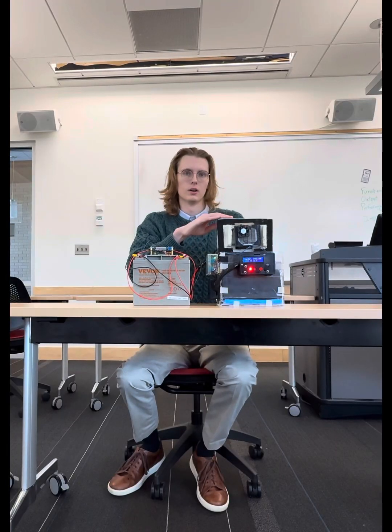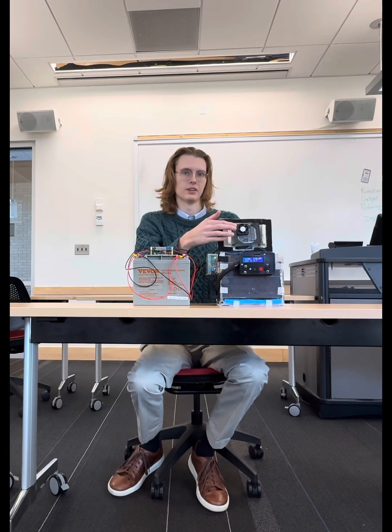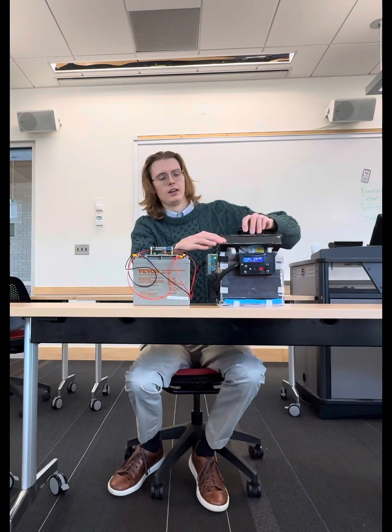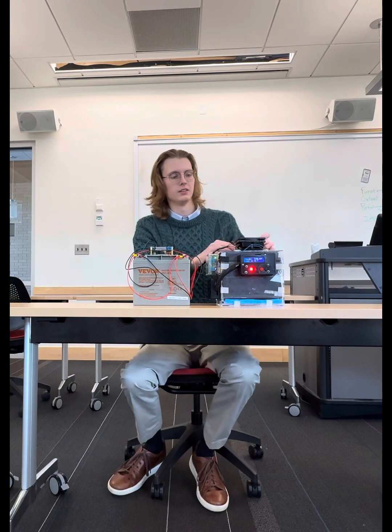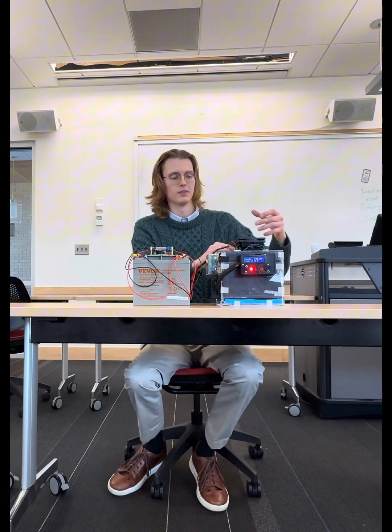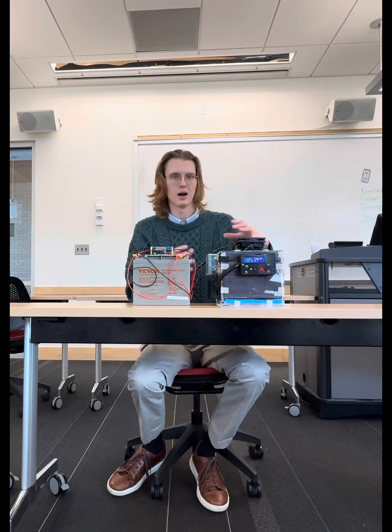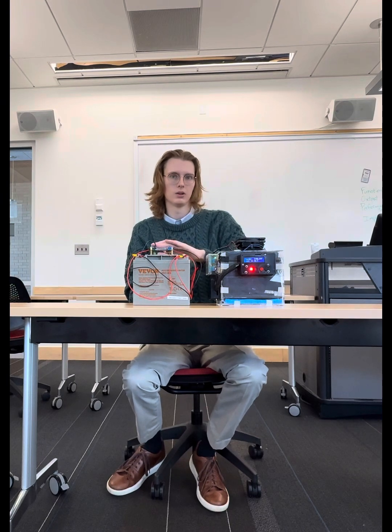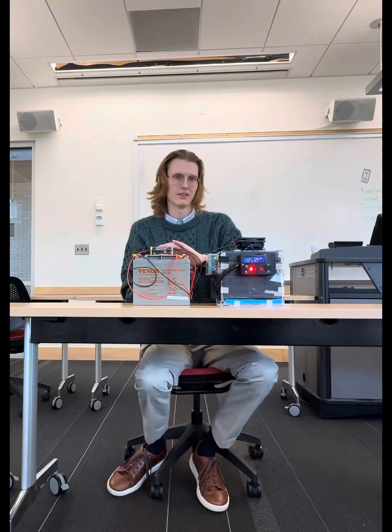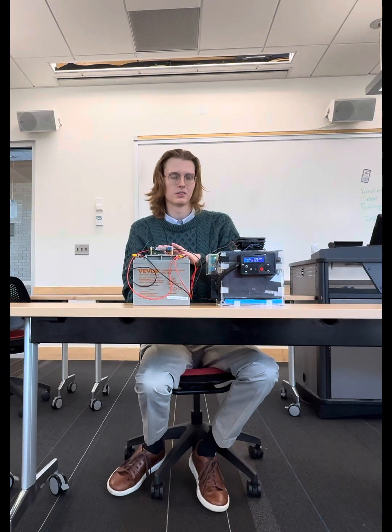So for our cooler, we use a Peltier to cool it down. We've got a heatsink on this side with a fan to get the air circulated across that. And on the heat side, the hot side, we have a similar setup. We can see a heatsink and a larger fan to keep the heatsink at ambient air temperatures. For our Peltier, we found out that there is an optimal operating range, which for this Peltier is 12 volts, 3.5 amps. Right now we're running at 3.7 amps, 11.5 volts.